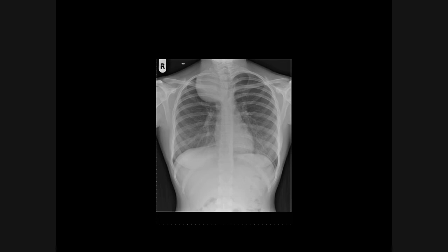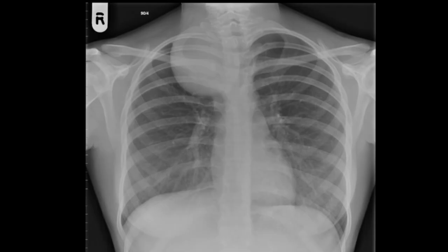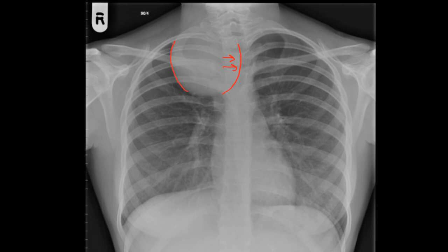Here is a patient who has a posterior mediastinal mass on a chest radiograph. Notice that the mass lesion is sharp below, at and above the clavicle. Notice also that because the mass lesion is quite big, it's causing deviation of the trachea to the left hand side. So deviation of the trachea does not necessarily have to be caused by an anterior mediastinal mass. In this case it was due to a schwannoma.